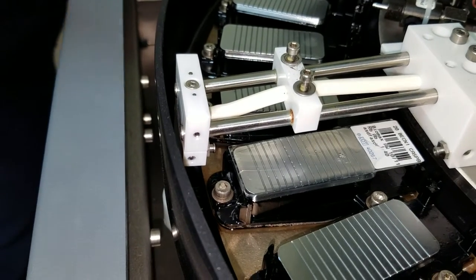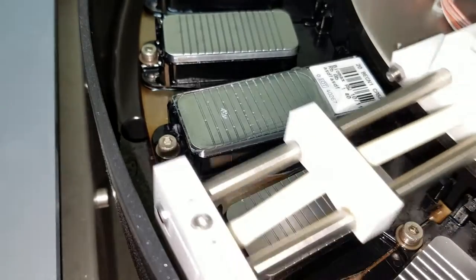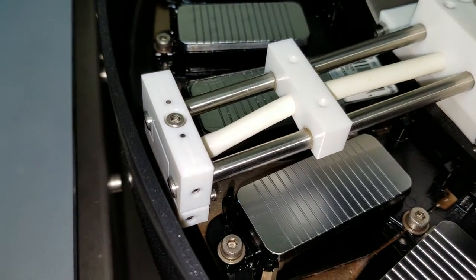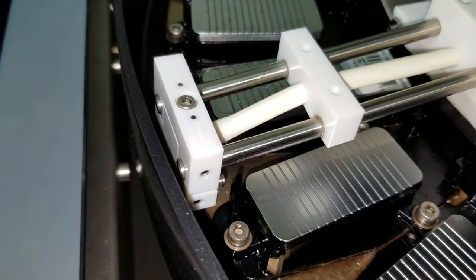Now if you notice, there are two layers in there. The cover slip will settle a little bit. Usually by the third or fourth mix you should see really good results.